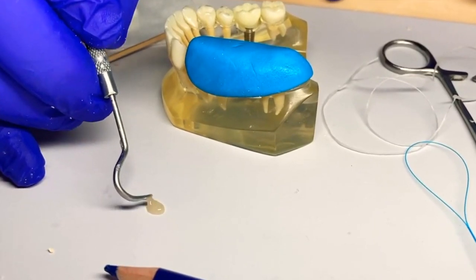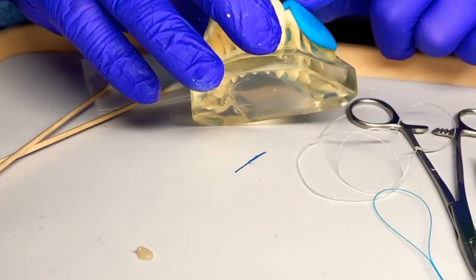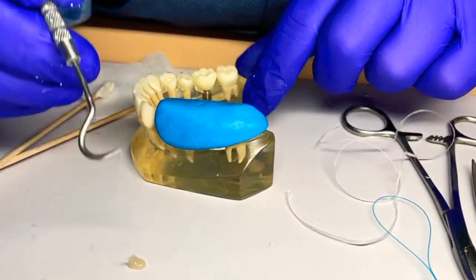Checking to see if our material is setting up — we don't have much oozing, so that's good. You can see we just have it all around: the lingual's covered, the buccal's covered, and it's starting to set.